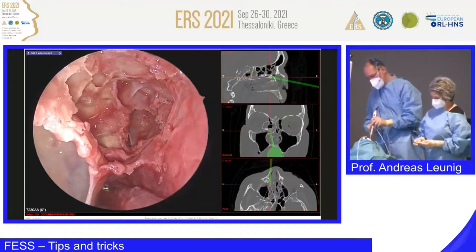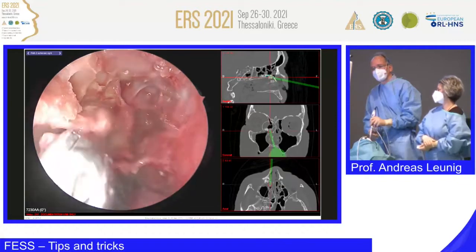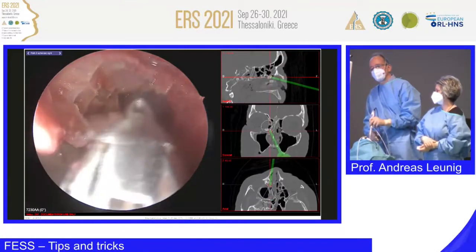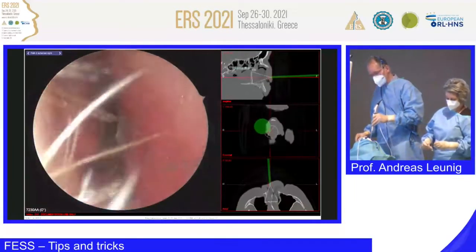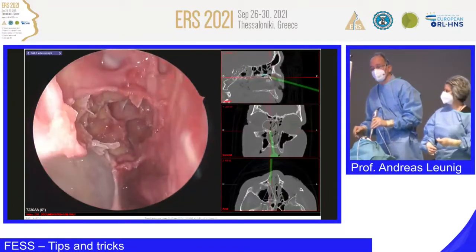Now we are doing a wider opening, but once again, this is only to show you the possibilities, and it always depends on the single case. This is not a routine maneuver. It depends on the patient's pathology as well, and the anatomy.